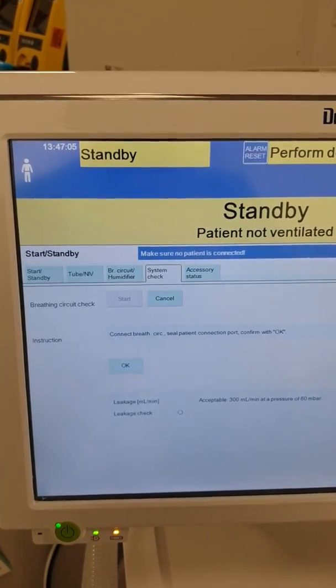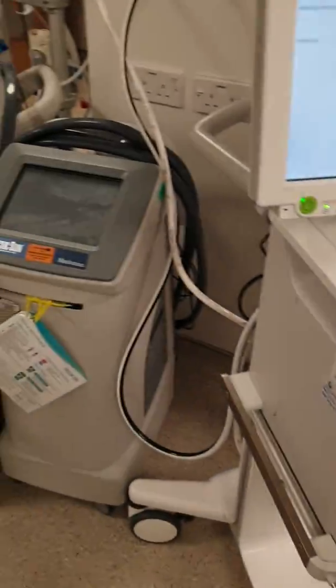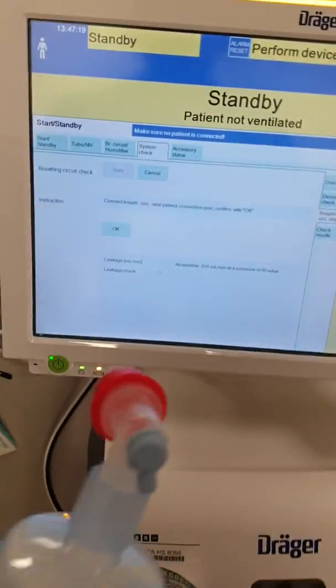Connect breathing circuit, seal patient connection port, confirm with OK. So the breathing circuit is connected and the patient end is occluded, so we can press OK.